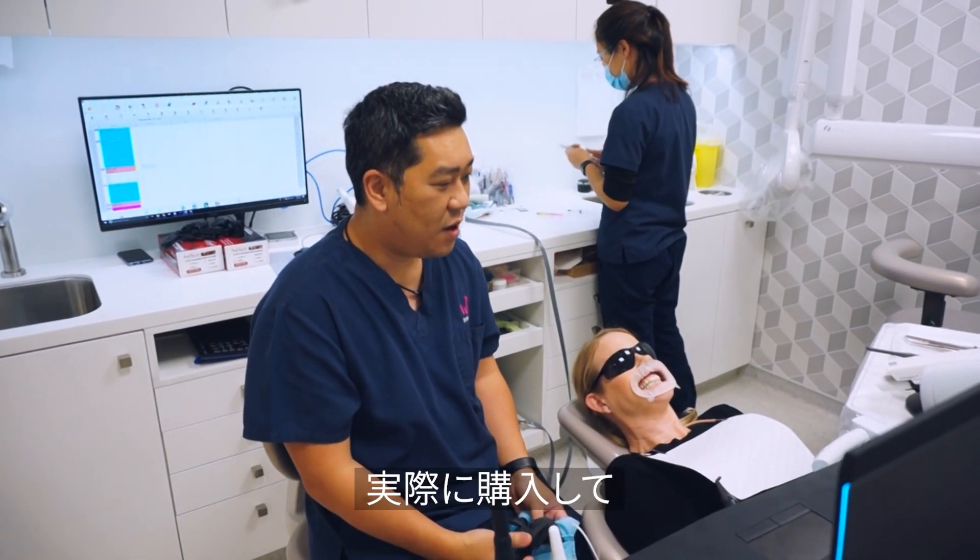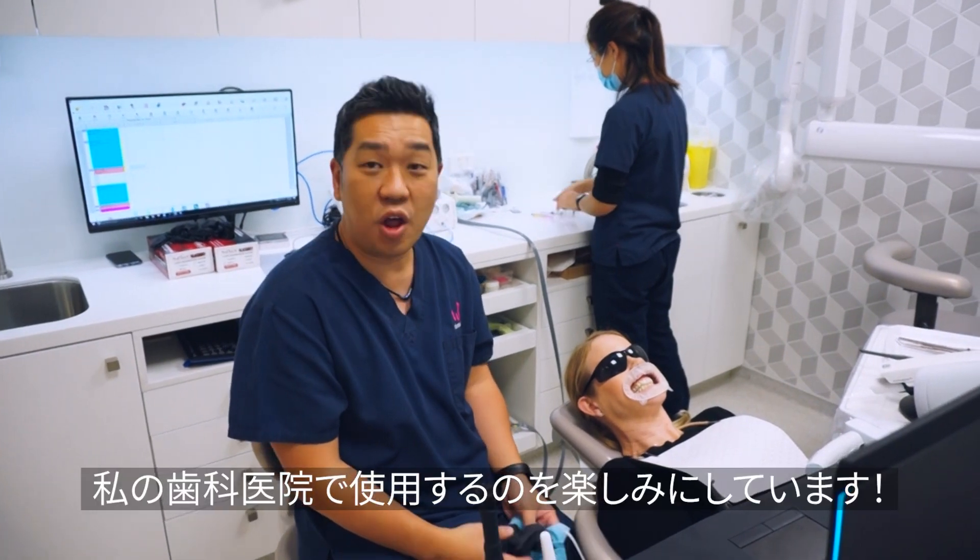3Shape, thank you for letting me test drive the new Trios 4. I'm really looking forward to having one in my own hands and applying it in my clinical practice.